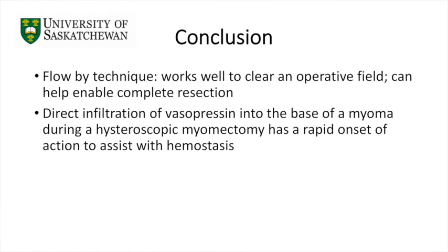In conclusion, the flow-by technique works well to clear an operative field that has become obstructed with tissue or blood, and can help enable complete resection. Direct infiltration of vasopressin into the base of a myoma during hysteroscopic myomectomy has a rapid onset of action to assist with hemostasis, enabling visualization to perform a complete resection, even when used intraoperatively after bleeding occurs.